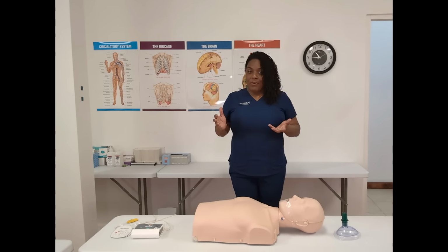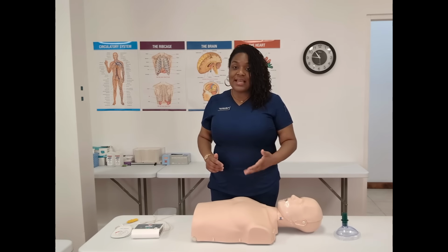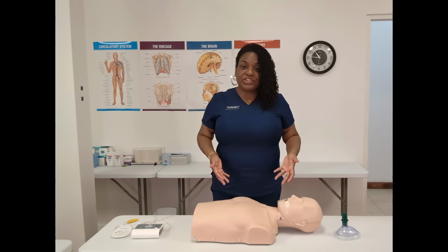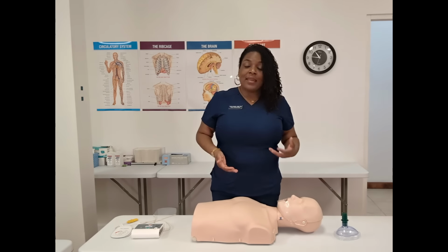Now we need to check for responsiveness. So we're gonna go to the victim's shoulder and we're gonna say, hey, are you okay? Are you okay? We're gonna tap and we're gonna shout. We're just not going to shout because the person could be deaf. And I really wanna try to stimulate this person because I don't wanna be compressing on their chest if they don't need it. So I'm tapping and I'm shouting and the person is non-responsive.